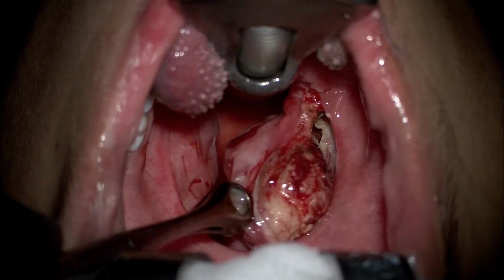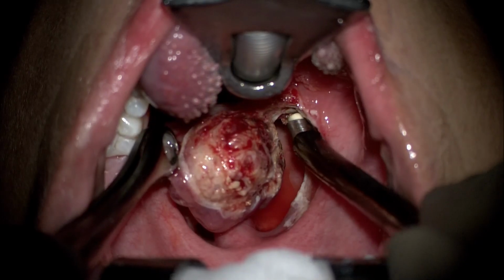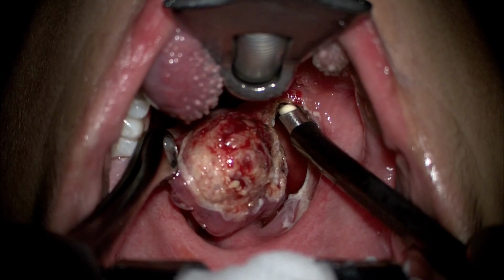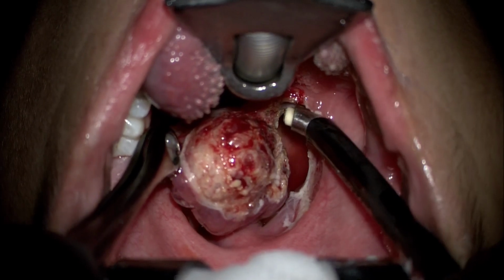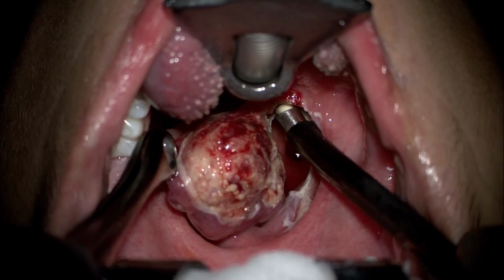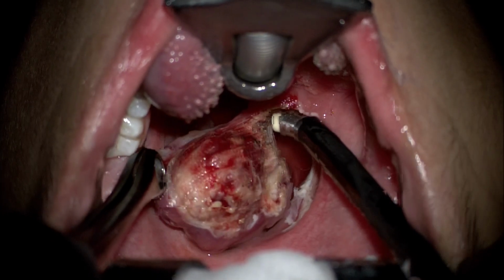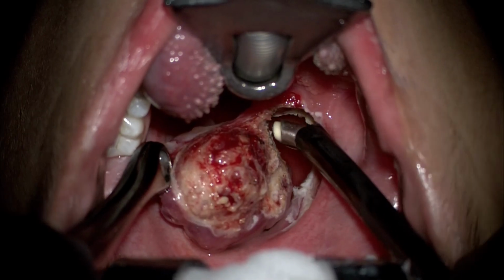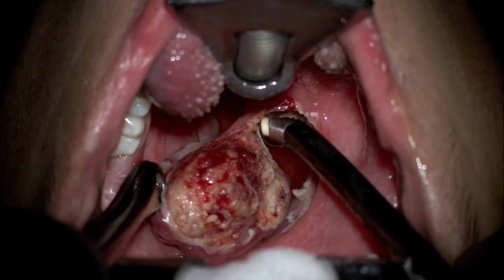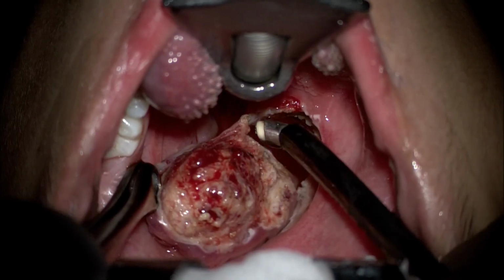So, the coblation tonsillectomy helps us in managing the entire procedure using a single device, and bleeding sometimes, if a little, can easily be managed using the same device without resorting to any other equipment. As you can see here, the inferior-most pedicle of the attachment is still there, and assuming that it may contain some branches of the tonsillar artery, we keep using the coagulation as well as the ablation mode, as well as avoid going too laterally towards the tonsillolingual region, because that would incite more pain.